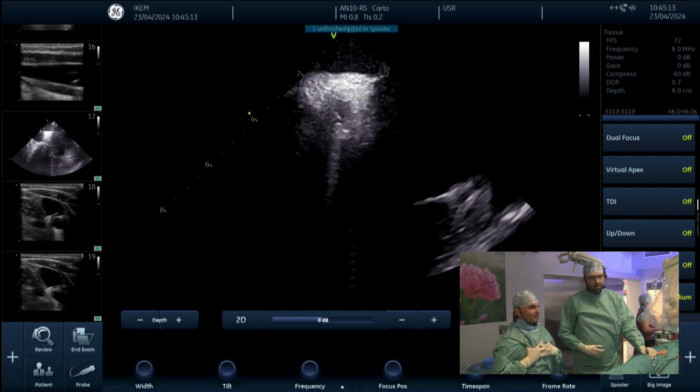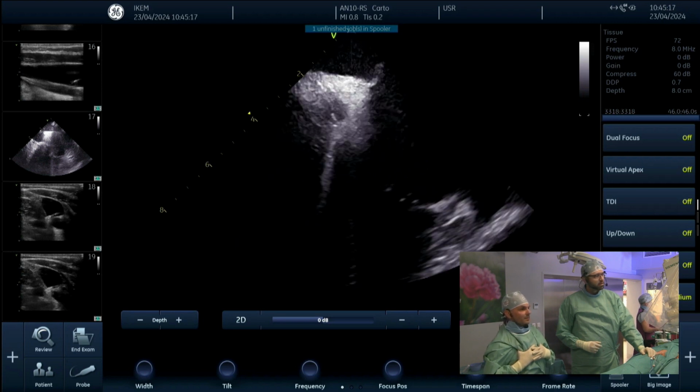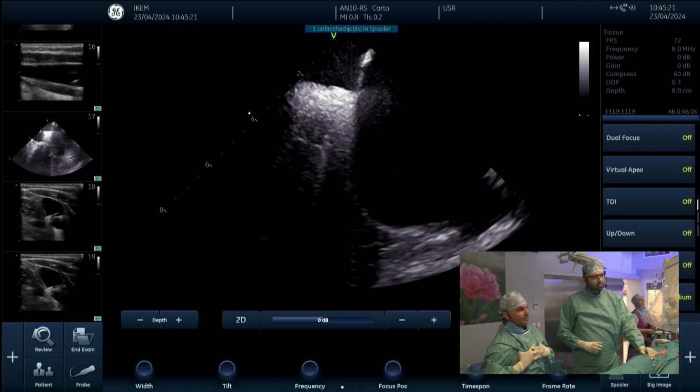Yeah, sometimes patients have valves in the jugular vein, so you cannot go so high with your catheter for stimulation. So if you can display the vagus nicely by ultrasound, as shown here, you can pace even lower. You don't need to go so high and across this valve in the jugular vein.